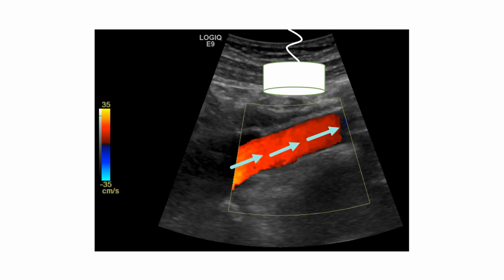We'll do the same thing with the curved probe. It's the same as a straight box. When we have a curved probe, we also assume our probe is on the top, and we use the angle of the vessel itself. Our vessel is red. Red is on the top. The top means towards, so there you go.